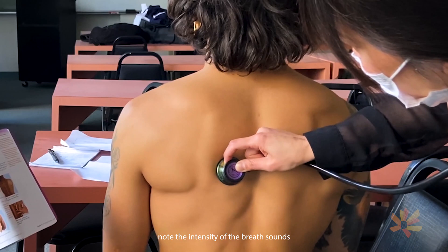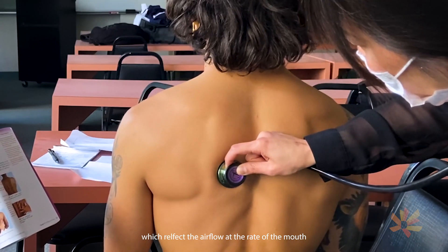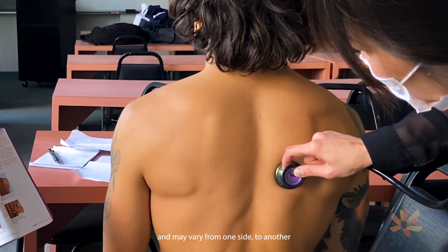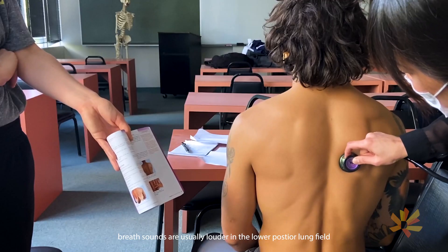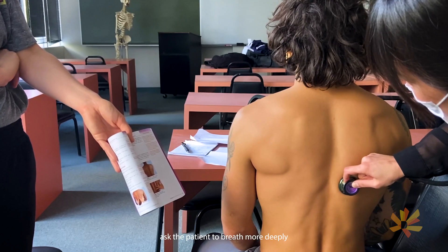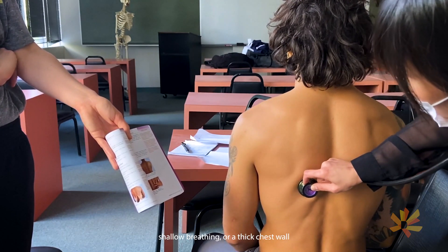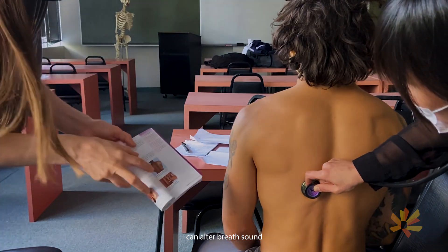Note the intensity of the breath sounds, which reflect the airflow at the rate of the mouth and may vary from one side to another. Breath sounds are usually louder in the lower posterior lung fields, and if breath sounds seem faint, ask the patient to breathe more deeply. Shallow breathing or a thick chest wall can both alter breath sound intensity.